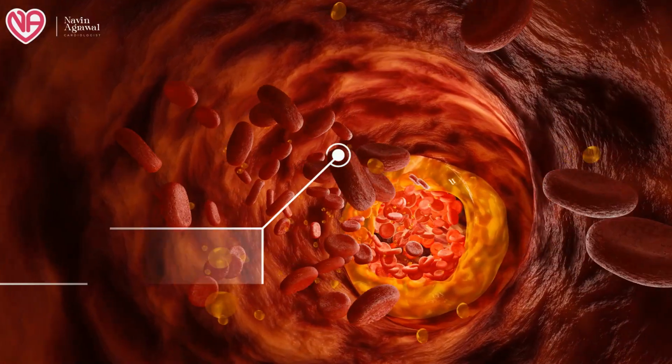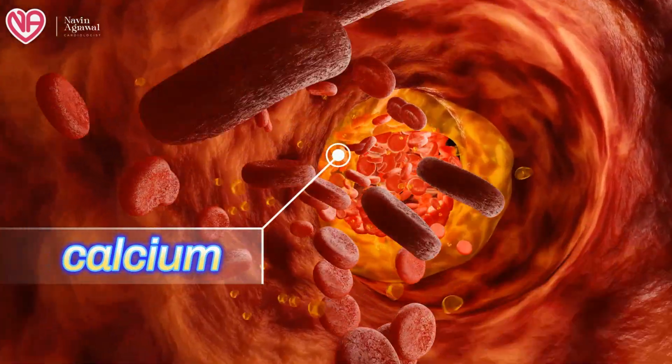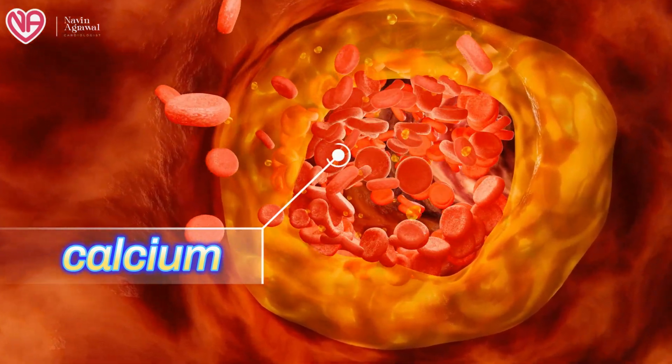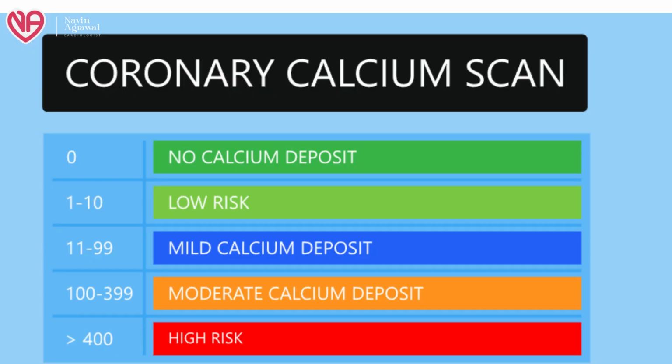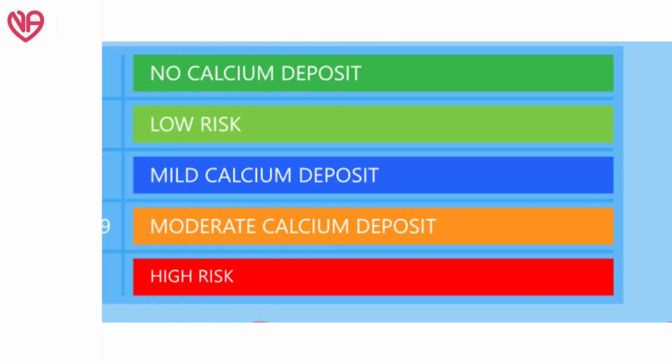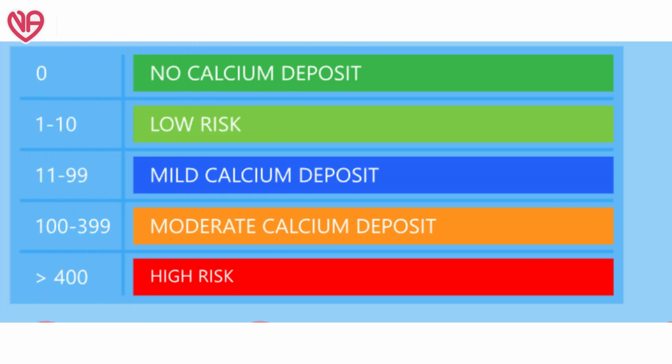Because with age, most of the coronary artery blockages tend to get more and more calcium deposition, and this calcium deposition can be picked up by a CT scan machine and the image can be demonstrated on the CT machine. So if at all we get a very high calcium score, that suggests that the patient is having significant coronary artery disease, and this finding has to be confirmed later by a CT coronary angio or a conventional catheter angio. If at all the CT calcium scoring is very low, then it is more likely that the patient does not have a significant coronary artery disease, and these are the patients where invasive catheter angio or a confirmatory angio may or may not be done.